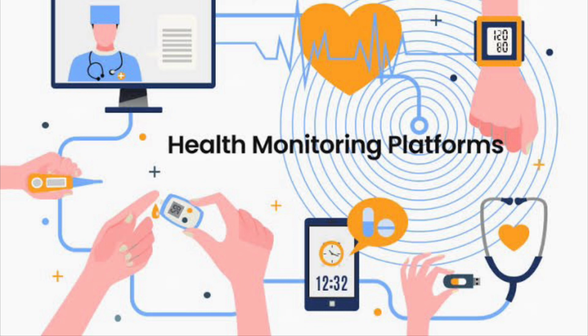The fourth step is to identify and recruit eligible patients. This one should be done with care. In the initial step, we identified the need for that. For example, if you are going to recruit only patients in the immediate post-intensive care, or patients who need monitoring immediately after surgery or after a head injury or in the emergency, one should identify that group of patients and they should be recruited for continuous monitoring.